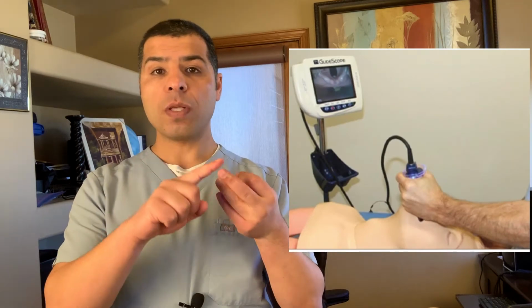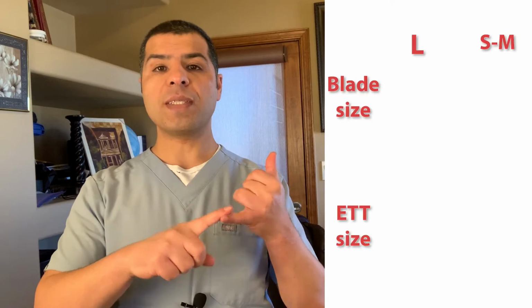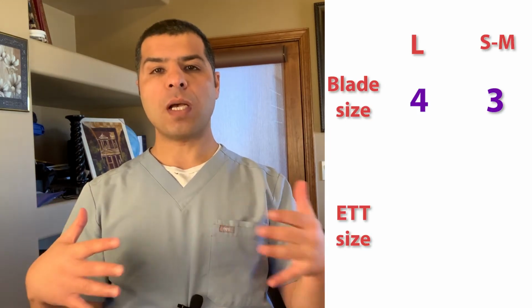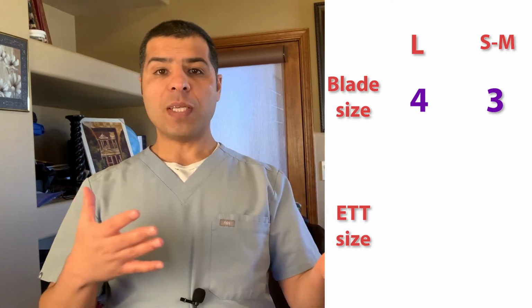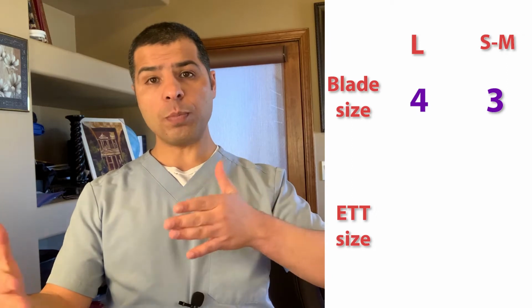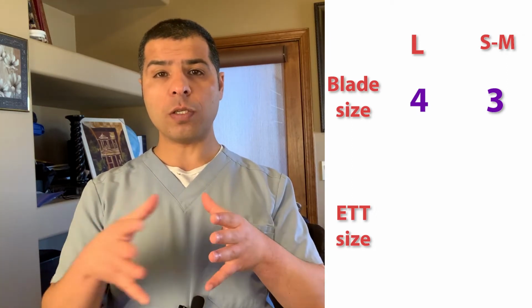You need to provide your respiratory therapist with the laryngoscopy type, the size of the blade, and the ET tube size. Remember, in large adults, we use blade size 4. In small to medium size adults, we use size 3. Now, some people decide based on the gender. I prefer really the large adult, small to medium size adults, regardless of the gender.